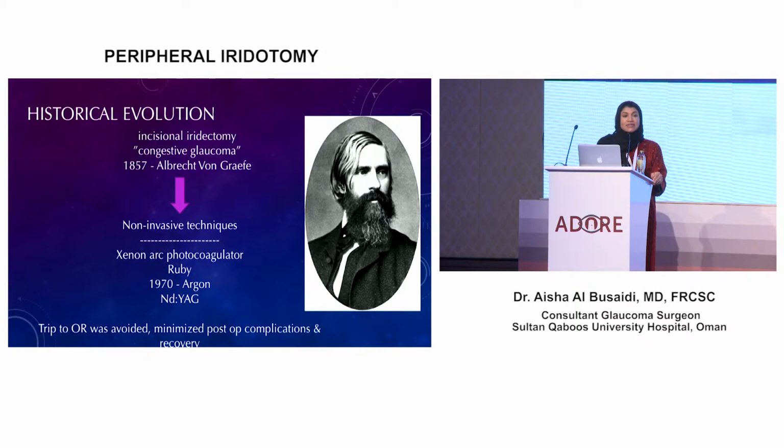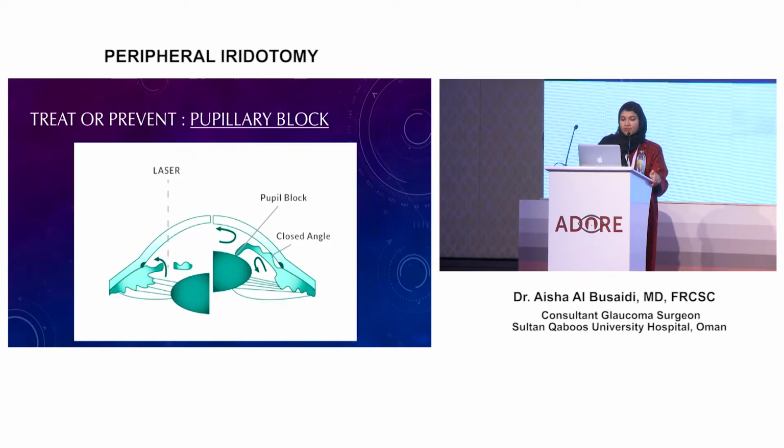And then in the 1970s, they started using the argon laser. Since then, it's been largely replaced more recently with the Nd:YAG laser. This all avoided a trip to the OR. It also minimized post-op complications and improved post-op recovery.